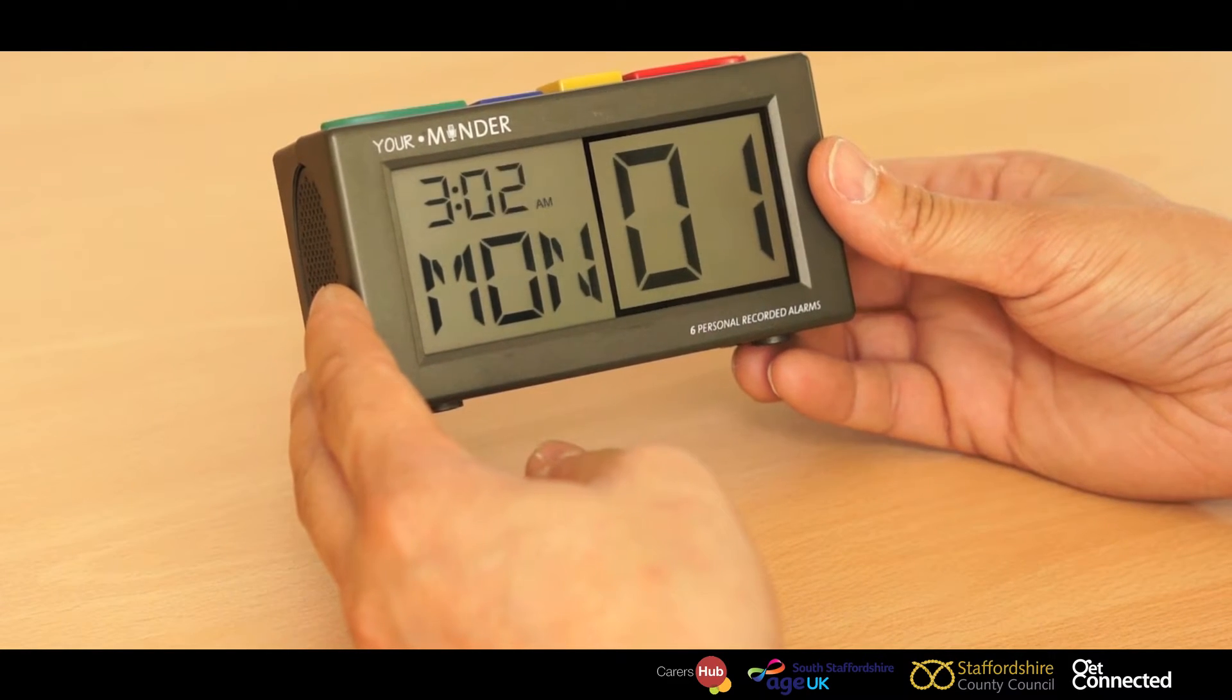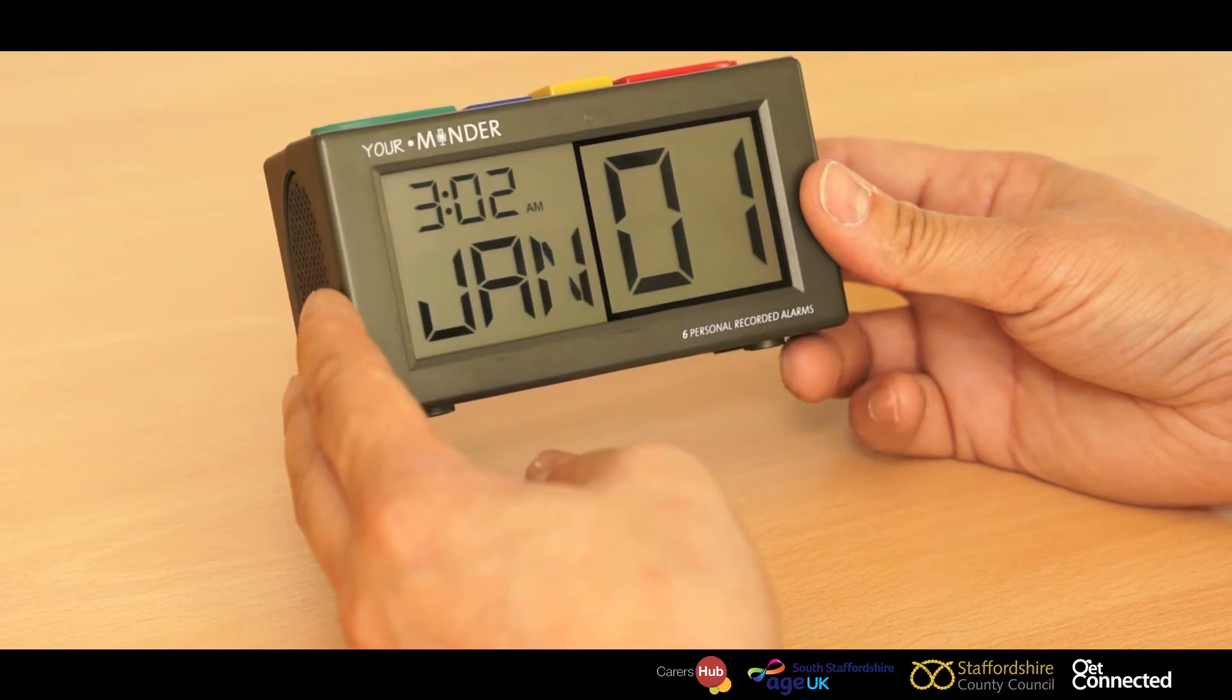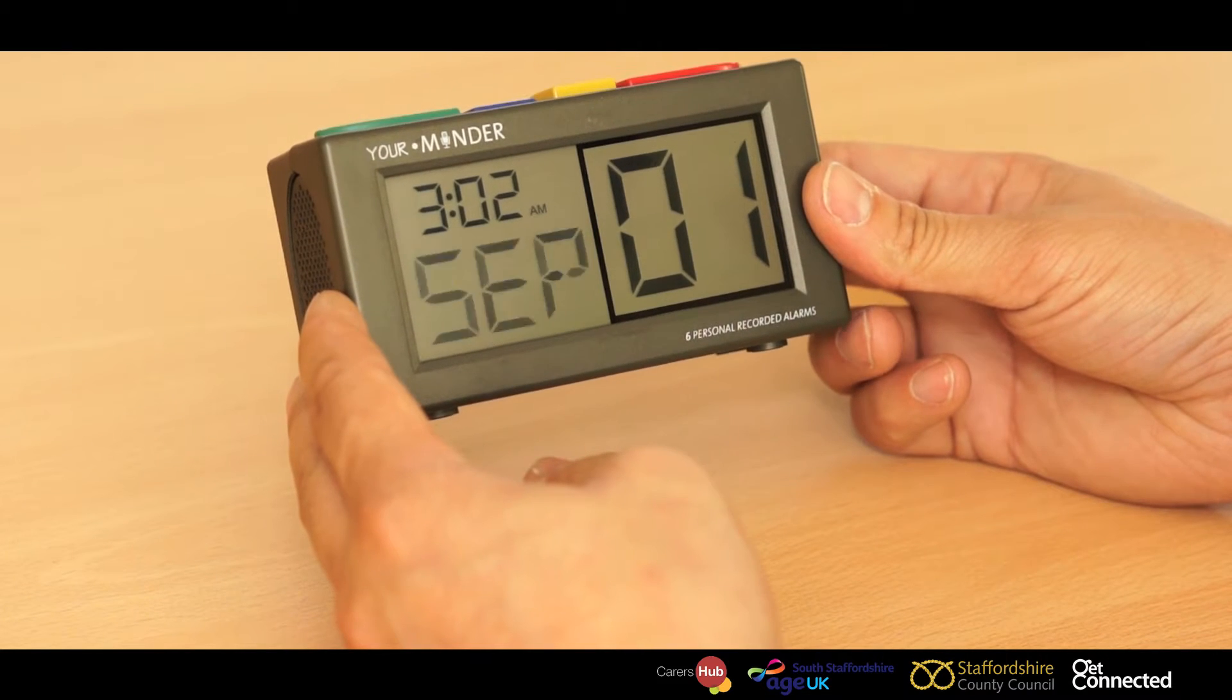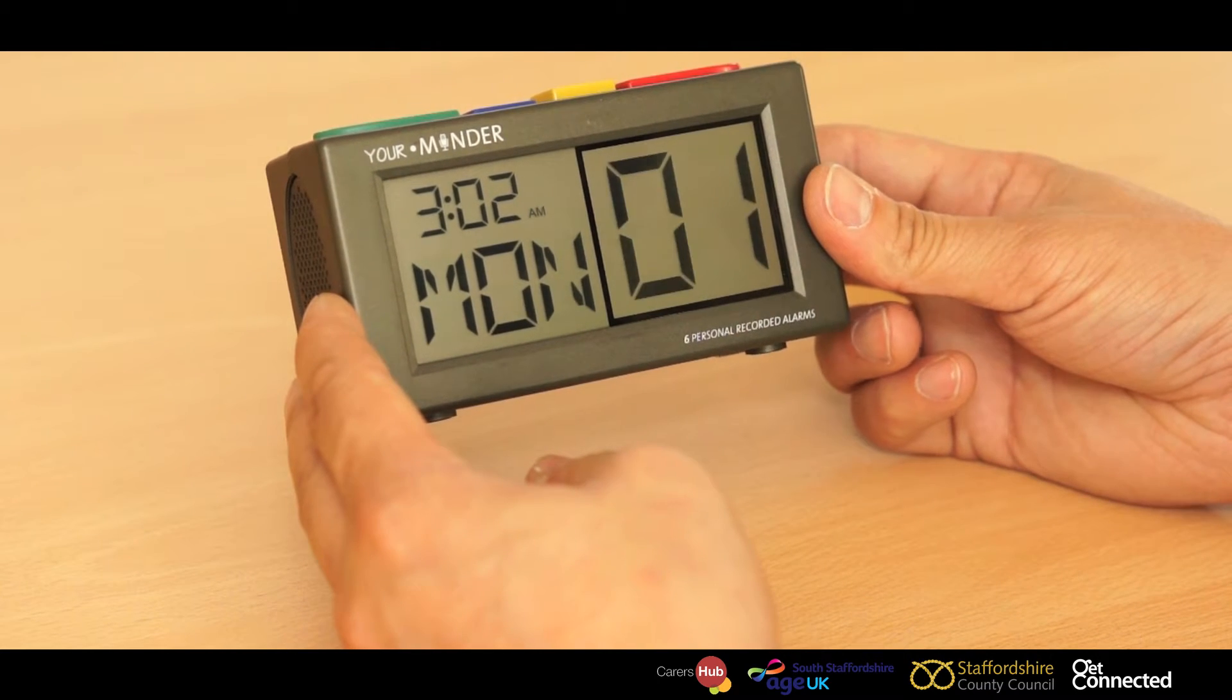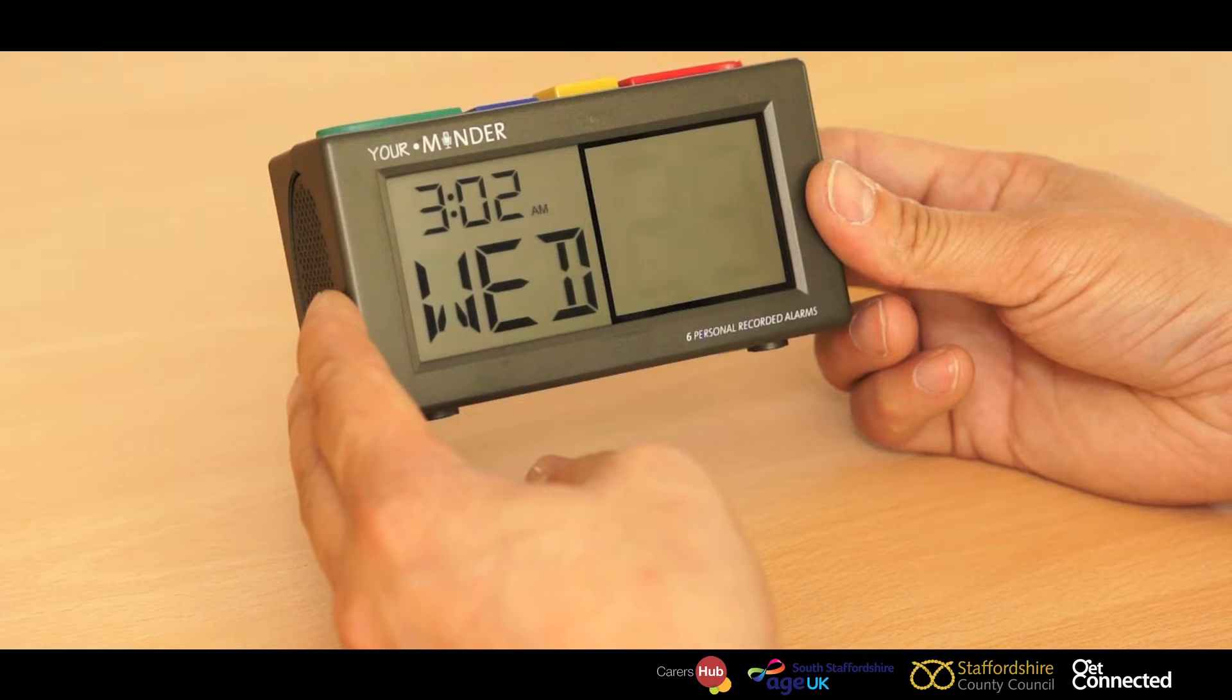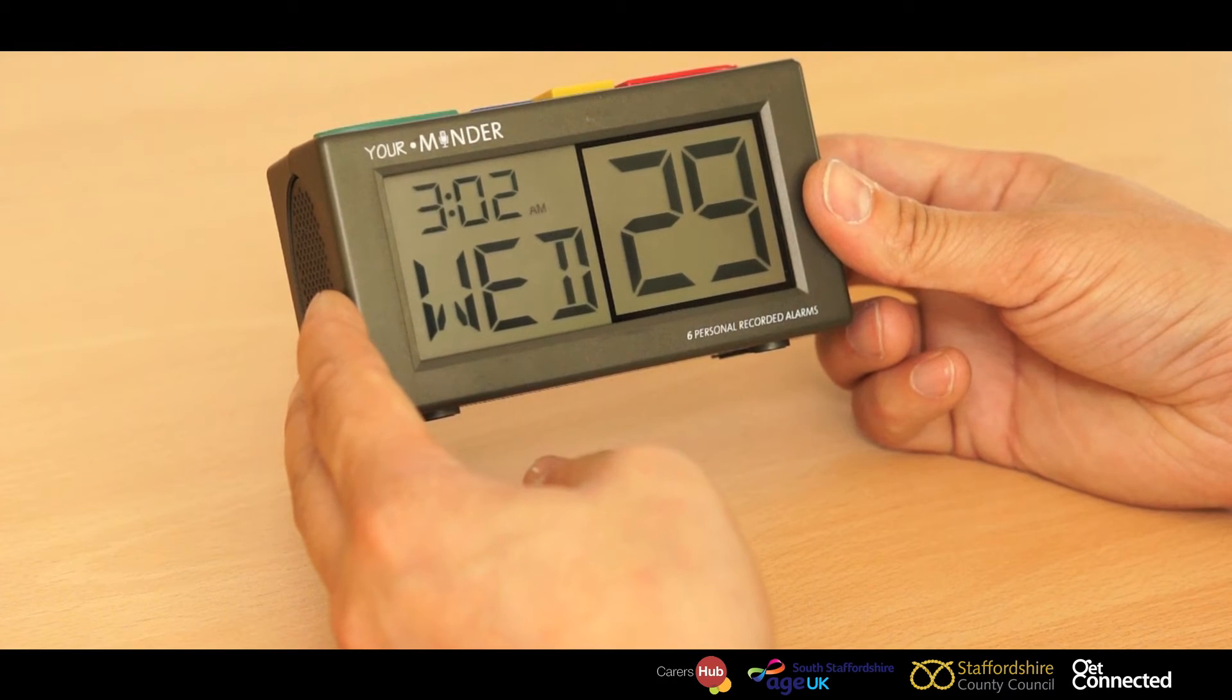We're now going to set the date, so we now push the advance button again. So we now scroll through again using the minus and plus symbols to get to the appropriate date. Once you're happy, push the advance button again and again and you're now set.